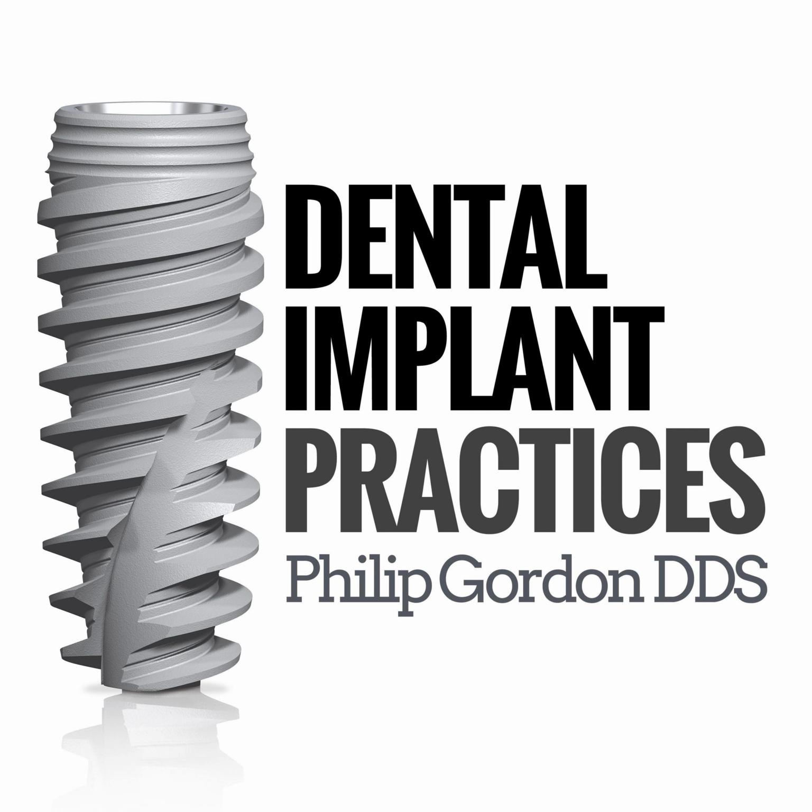I would like to look at 100 of their cases in that situation and see how many of those implants were perfectly placed. Because especially if you're doing a single tooth implant, placement is really critical. It's got to be parallel to the adjacent teeth. It's got to be centered on the ridge. It's got to be right under where the prosthesis is going to go. It's got to be equally spaced mesiodistally between the adjacent teeth.